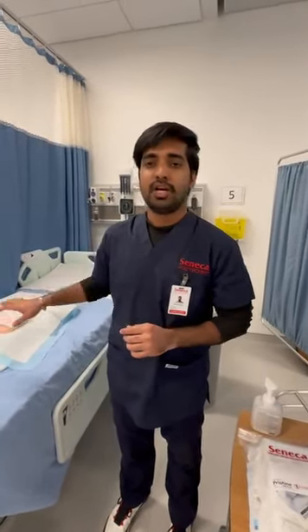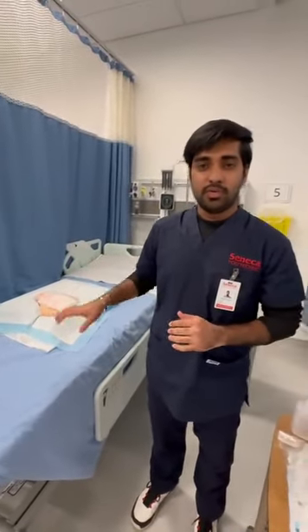My name is Praveen. I'm a practical nursing student at Seneca College. I will be demonstrating the wound assessment and how to set up a sterile field.